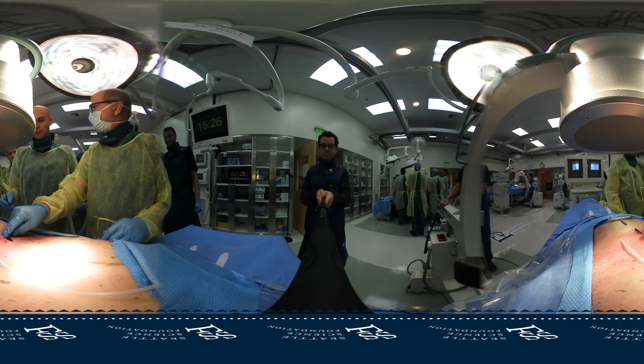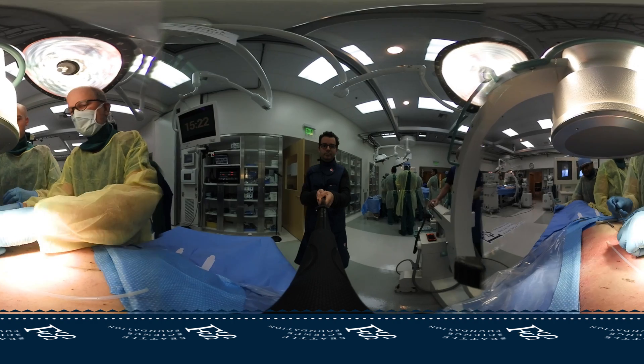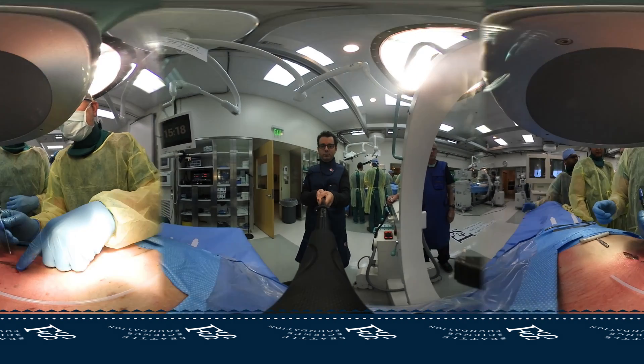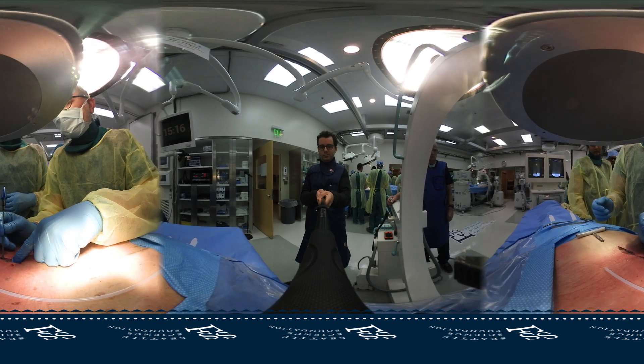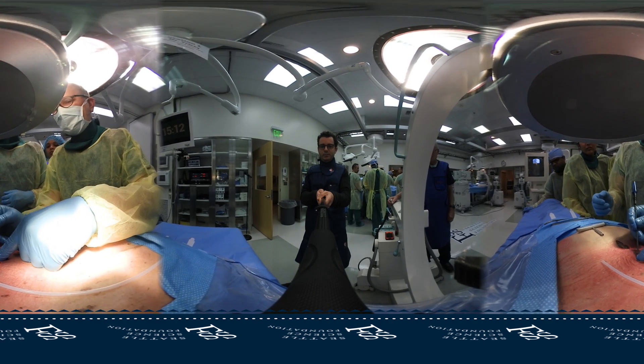You can use either incision you want — I don't care. The top one's bigger, so mine's going to go with that one. The level you want to be dissected down to is kind of this level. The person who did this dissection was off midline, so it's not quite where we want to be.